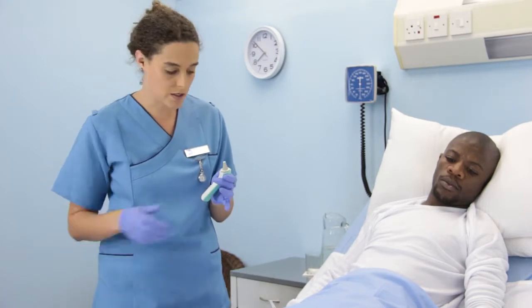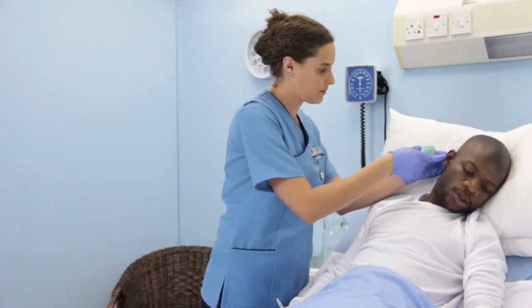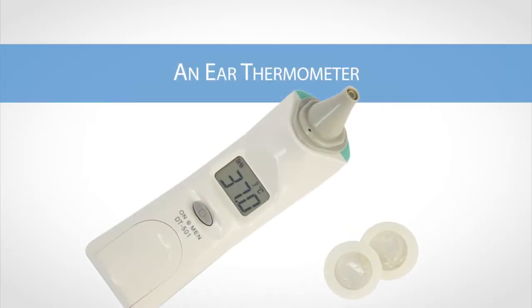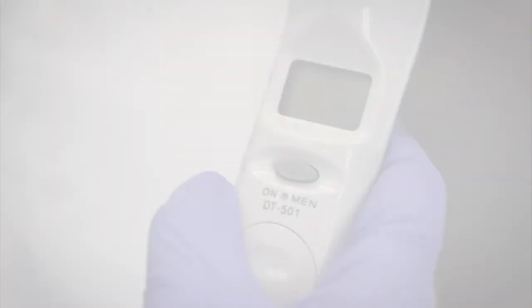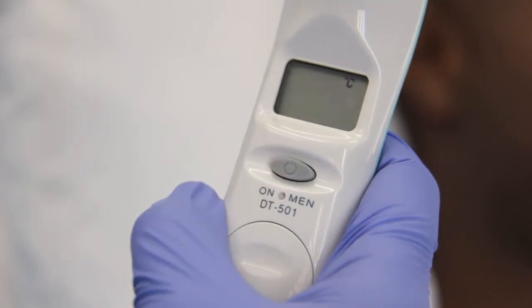Place the appropriate thermometer according to the site selected. The tympanic sites. In this demonstration, we will make use of an ear thermometer. Switch the thermometer on and wait for the indication that the device is ready to use.